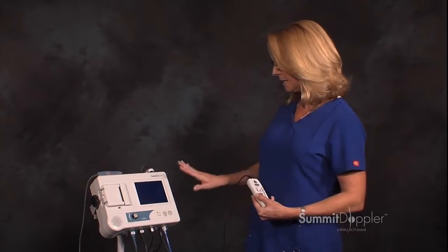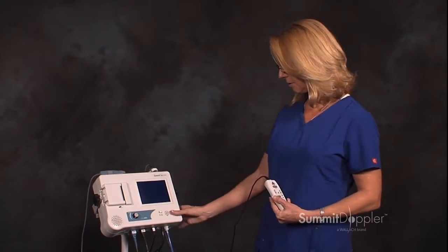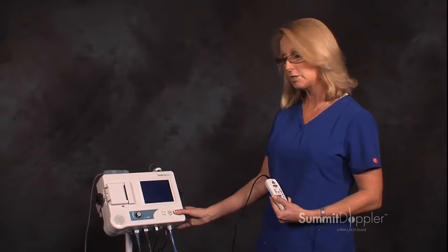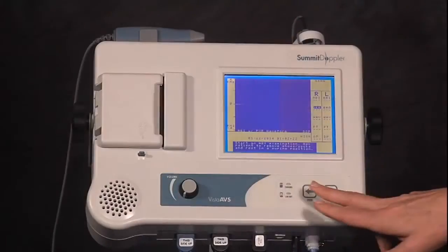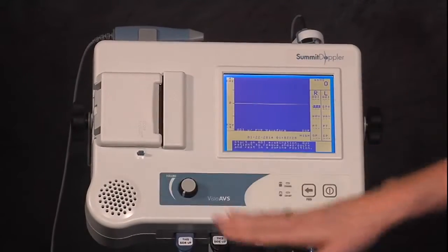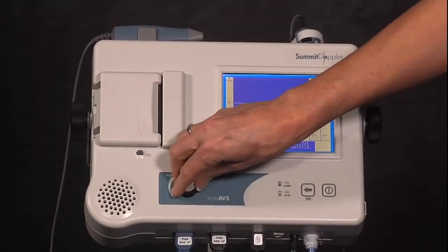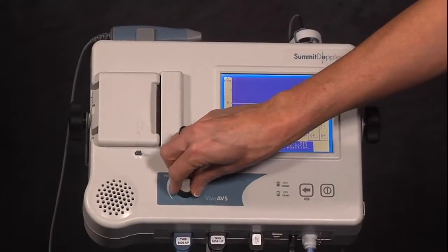We're going to be setting up the Vista AVS unit, walking through the menu options. Beginning with the front of the unit, we have our on-off switch, the feed button for the paper, the door release for the paper, and your volume control.